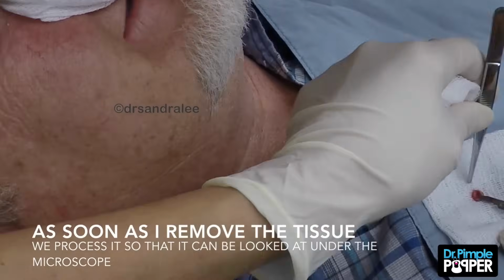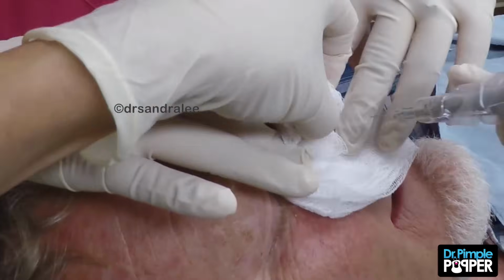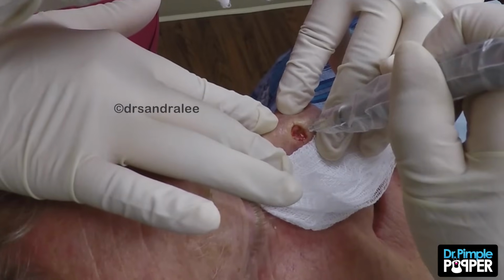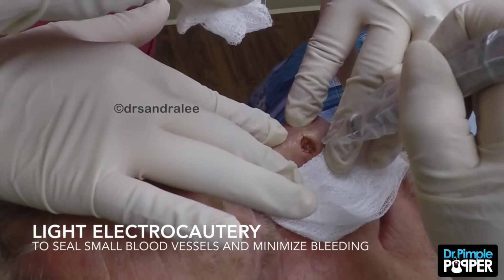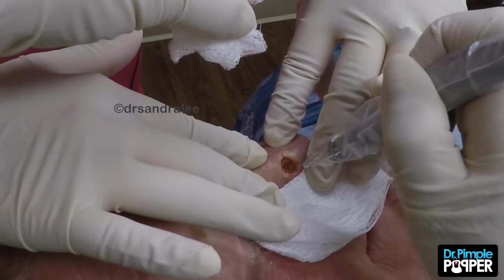With previous procedures, you just take a margin around it, and you're kind of guessing. You take a standard 3 to 5 millimeters around it, which is pretty big, and you only have so much nose. That's true. You have a cute little button nose. We want to keep it that way. Thank you for saying so.